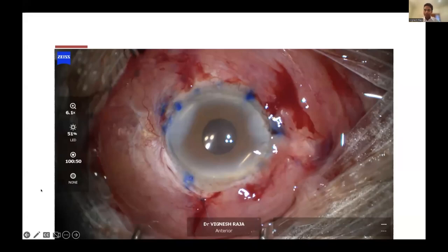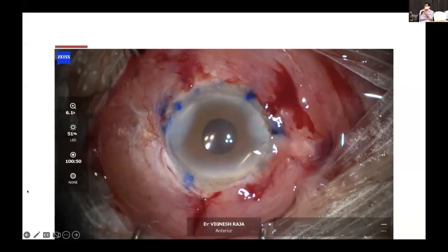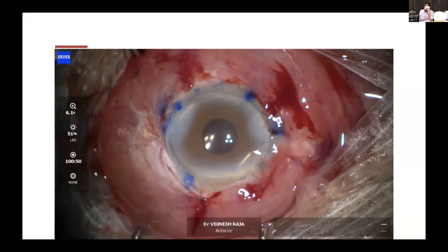So any questions from this case? This is fantastic skill. The only thing is, why did you go 2 millimeters and why 3 millimeters for the other one? I have seen people go from the blue-white junction, 1 millimeter behind that, and then one more millimeter, or even go vertically 1.5 and 3, rather than the same 2 millimeters adjacent to each other. That you don't do for sutures like this, what you did for the iris implant? This one, I did 1.5 and 3.